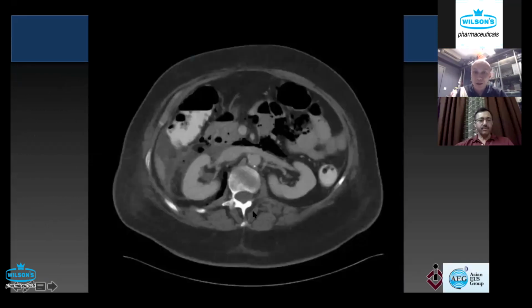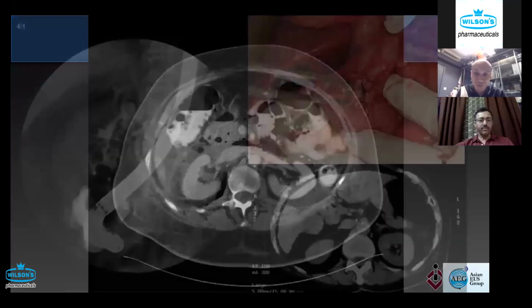So this is a CT of a patient complaining of severe pain after ERCP, and it shows the presence of retroperitoneal gas. Very often, if it's just gas, then these usually settle with conservative management with drip and suck and antibiotics. And often the pain goes away in a few days, and you can resume the patient on a regular diet, or do a contrast study before you start.